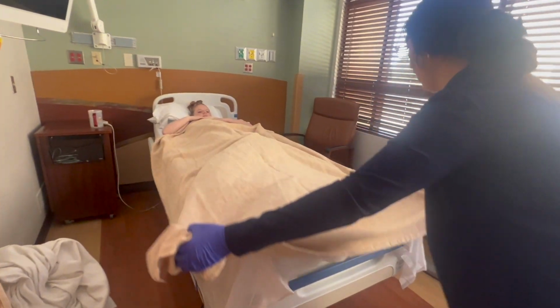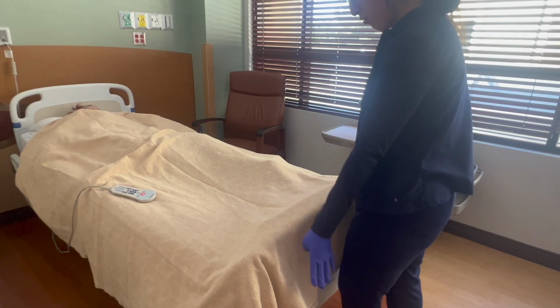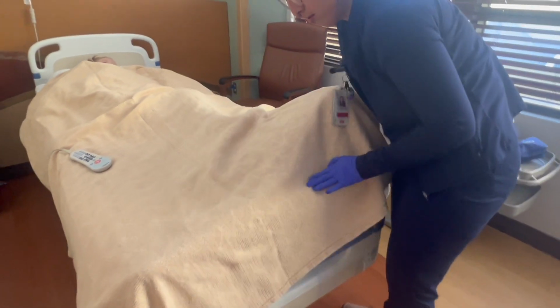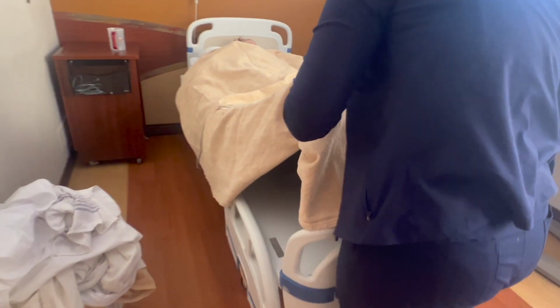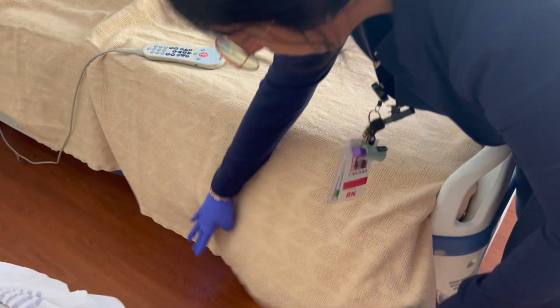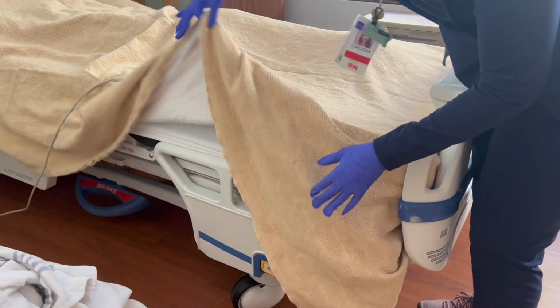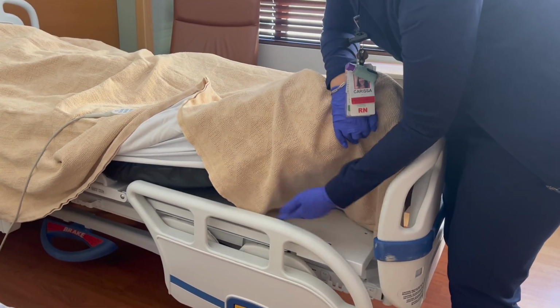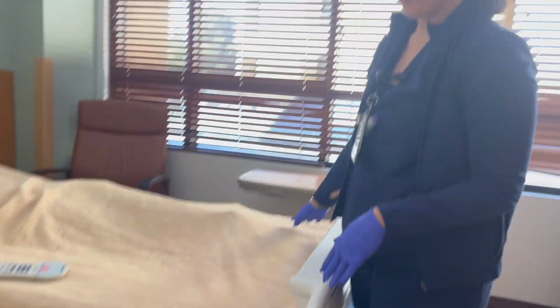And then putting it like that so that we can miter the corner easily. So to miter a corner, we have this hanging over the bed. I like to lift it up and tuck it under so that it's easier to work with. And then once we do that, then we can pull up near the end, but not entirely at the very bottom. And then you have a little triangle. You tuck in the excess and you pull it over. And you'll do the same thing on the other side.